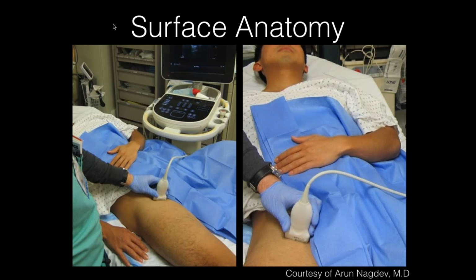The surface anatomy here is demonstrated in these photos. You're basically going to place your transducer as if you were initially looking in transverse fashion at the femoral vessels. So the probe marker is going to be lateral, patient's right, and you're going to initially get the vessels in view, and lateral to the vein that you're accustomed to looking at for femoral line placement is going to be the artery, and lateral to that artery is going to be the femoral nerve and some associated other tissues.